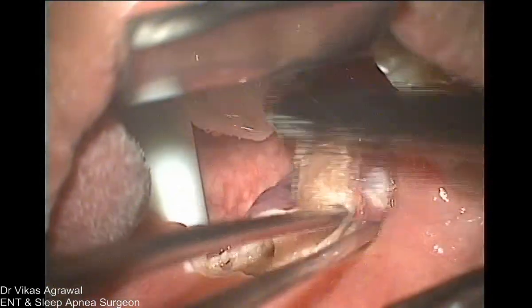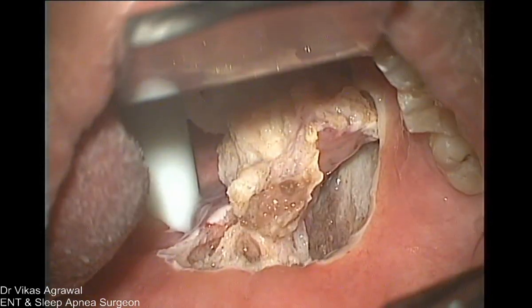Now we'll change this to the other side. See this, we didn't even take 10 minutes. I'll change the mouth gag to the other side because it's nasal intubation. It's much easier. You don't have to change the side of the tube. It will be much easier and faster. Another 10-15 minutes for this, and another 15 to 20 minutes for the tongue base. So that's how we can plan for our next sessions in the auditorium.